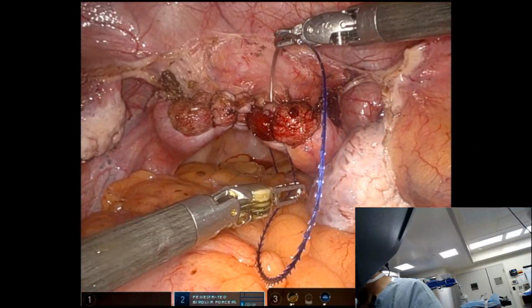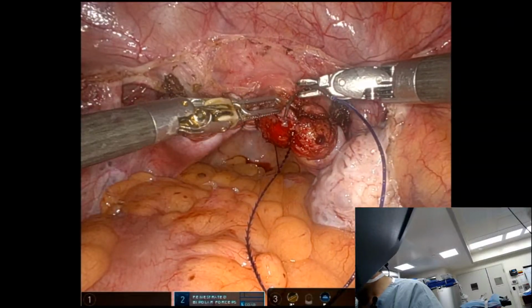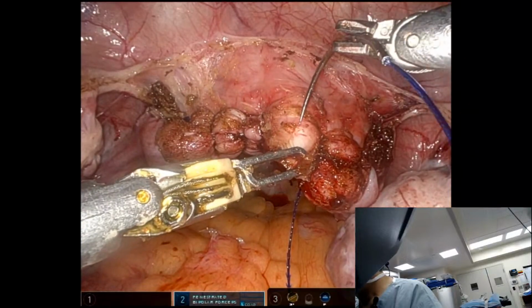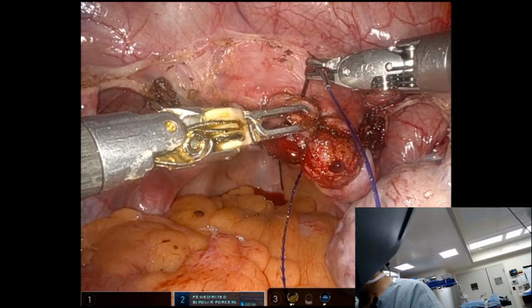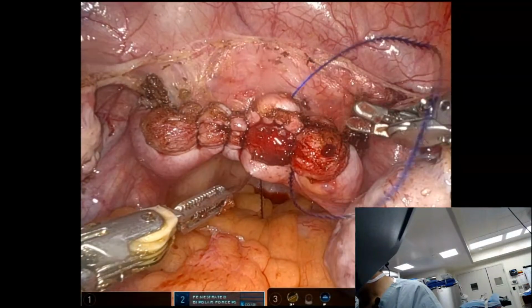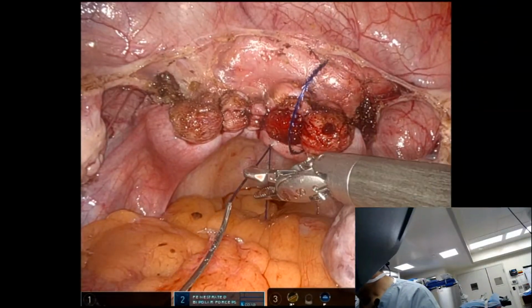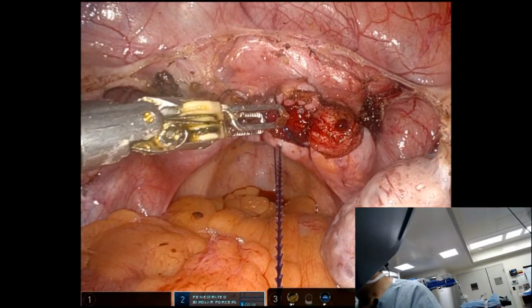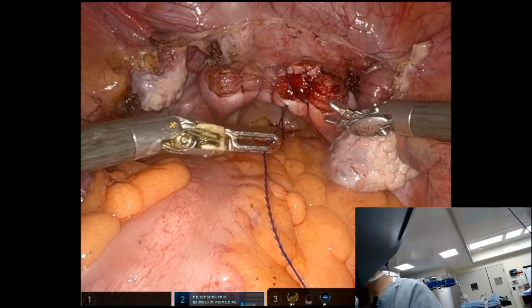A straightforward hysterectomy will take you between 20 to 30 minutes to finish. Minimal bleeding is important. Some patients will have a history of irregular periods, so they already have anemia, so you don't want them to bleed more during the surgery.